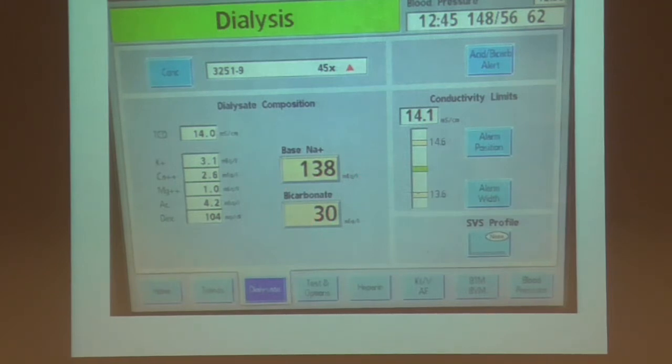This is kind of cool with SLED, is we can actually adjust the dialysis. So sometimes ICU nurses will say, they're acidemic, what do you want to do about it? We can dial the bicarb all the way up to 38. 36 is usually where we keep it as the highest, since I don't feel comfortable giving more bicarb than that. If they're running for like 20 hours or so, we can leave it at 24. And after about 6 hours, when you check CRRT labs, it starts to balance and they all look perfect. It's because we're running a physiologic bath, and that takes about 6 hours. Then we can adjust calcium and potassium; magnesium is a fixed amount in the bath, and dextrose is fixed too. So potassium and sodium bicarb are what we mess with the most.